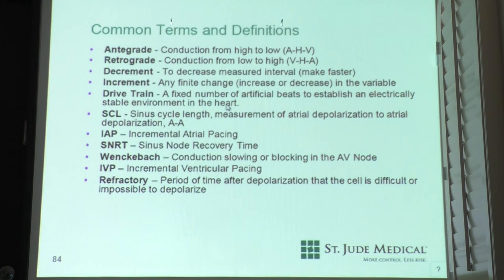All right. So some basic terms and definitions that we have been using a little bit. Antegrade, retrograde: something going forward from the A to the V is antegrade, right? Retrograde, backwards. To decrement is to reduce, increment is to increase. When we give a drivetrain, it's basically an equally spaced sequence of artificial beats.